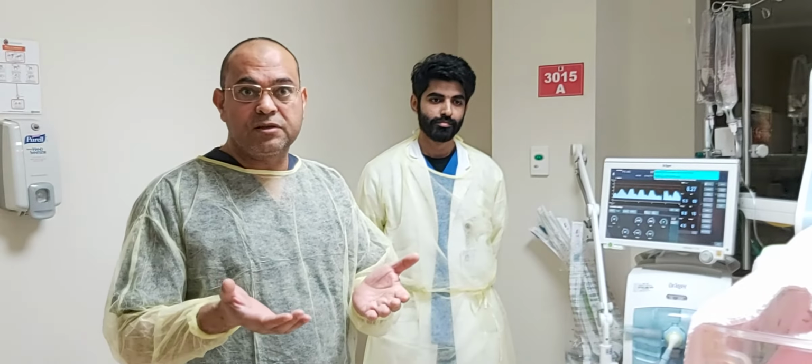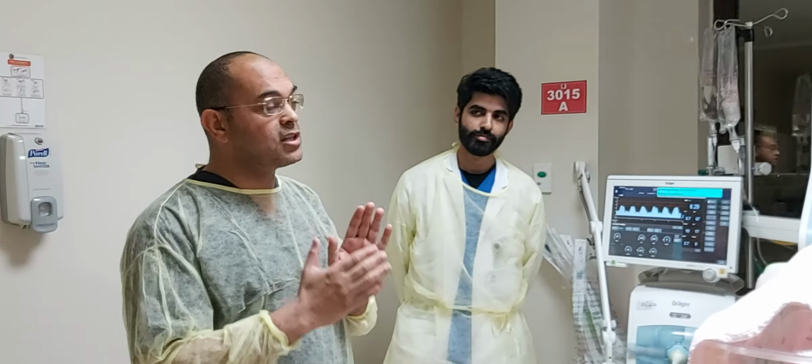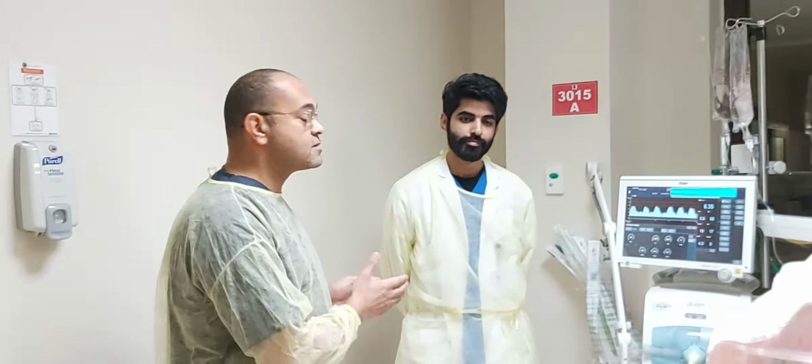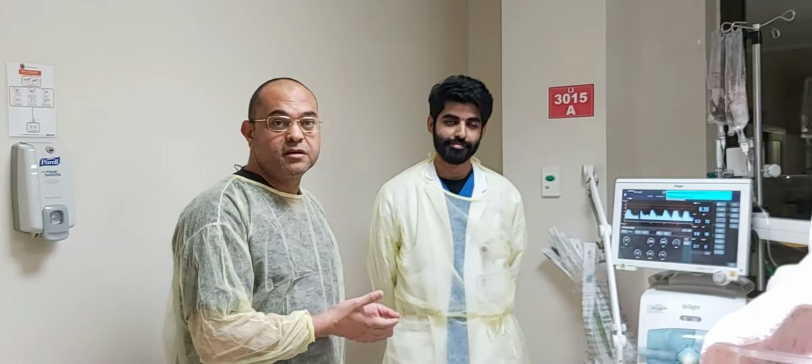We requested a blood gas, which showed respiratory acidosis, and we put him on conventional mechanical ventilation, but unfortunately the baby still desaturated and could not maintain saturation, with respiratory acidosis. So we decided to shift him from conventional mechanical ventilation to high frequency. Mr. Anas, our senior respiratory therapist, will tell us how to apply the high frequency.